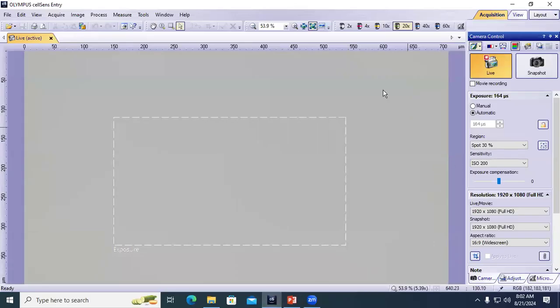We'll find out if I set this up properly. F11, there we go. Let's see if we can get a good sub-gross going. Wait, we like the cornea to our left.